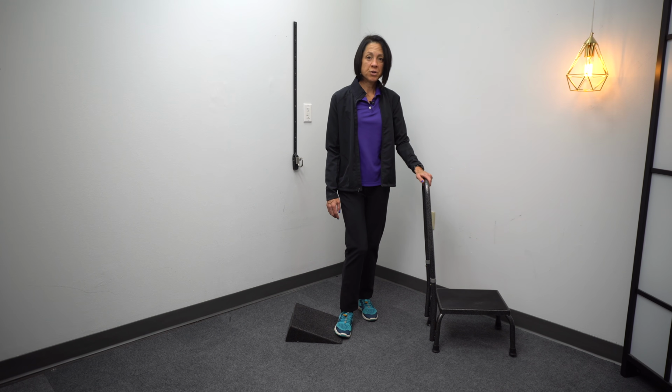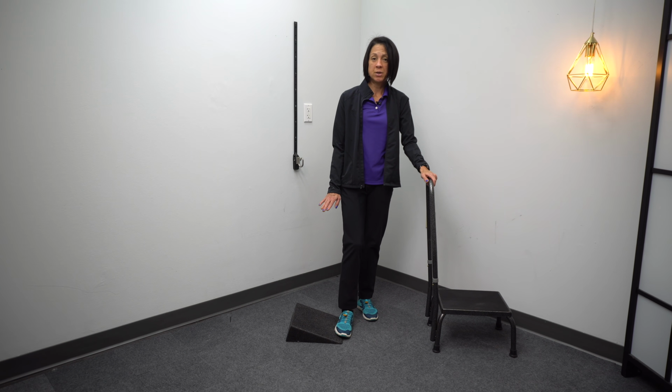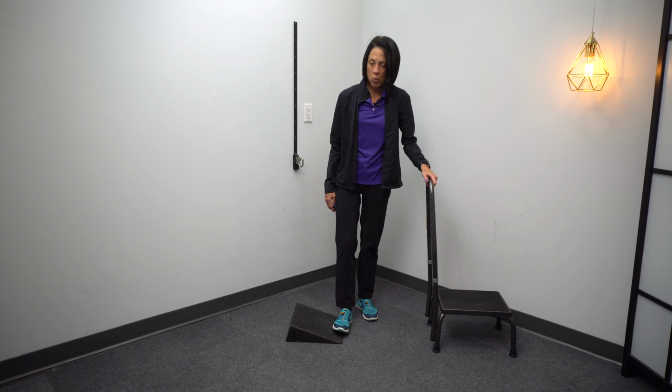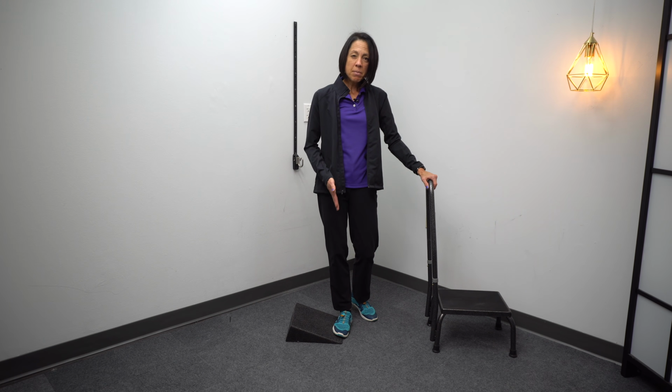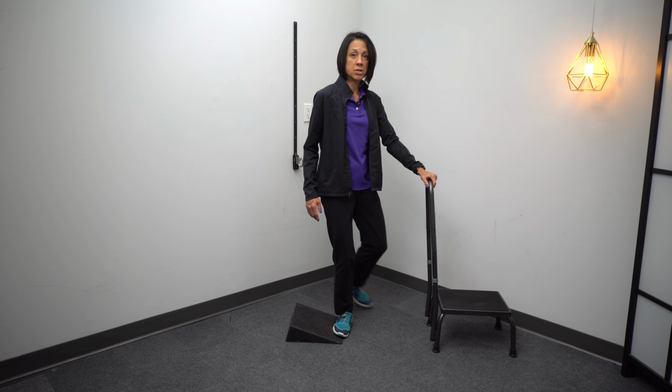You don't want to be overly stressing the inside of that knee by putting that foot too high on a wedge. The other thing is you definitely probably don't want to do this if you're someone that wears an AFO, because that will kind of throw your leg into what we call knee valgus position. So you want the knee maybe slightly more towards the big toe, but not severely going past the big toe, right?